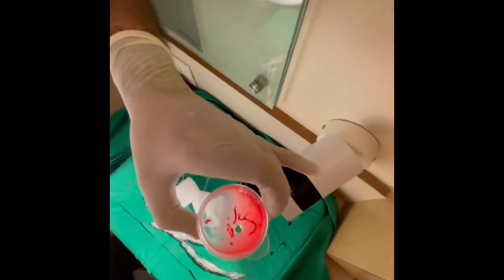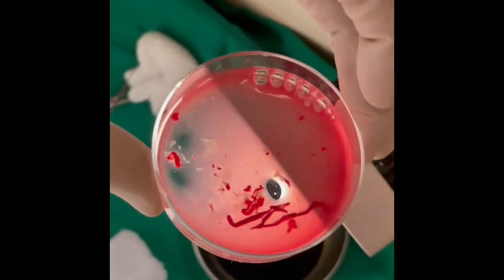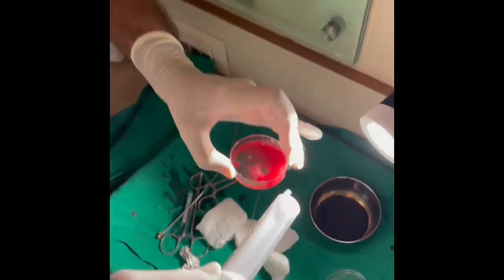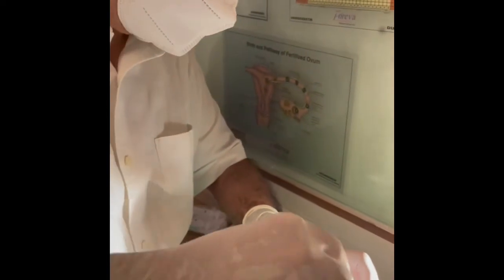You can see the villi. Now, in the same syringe, just pick up these villi.